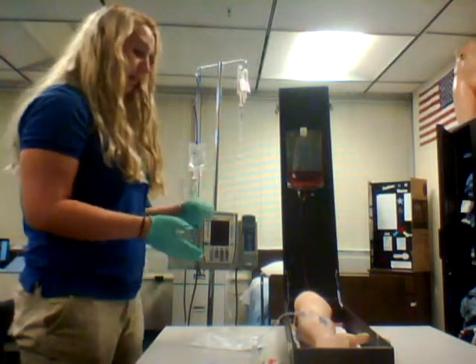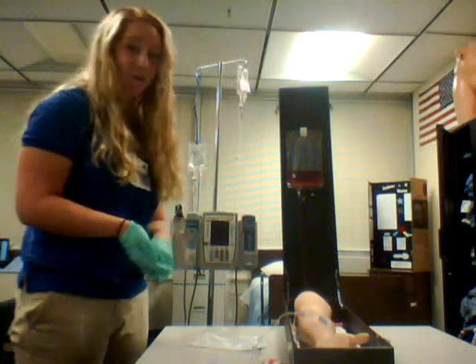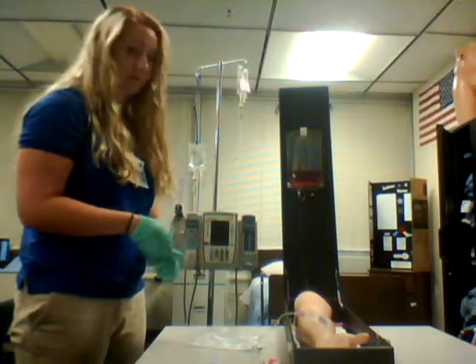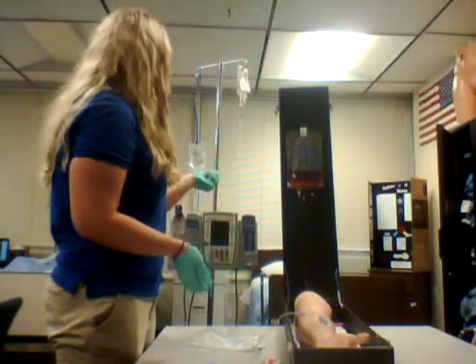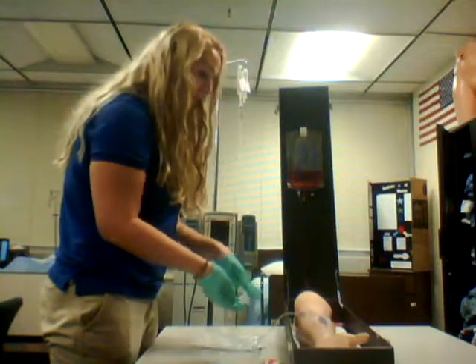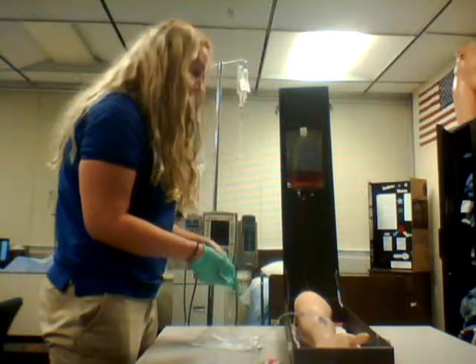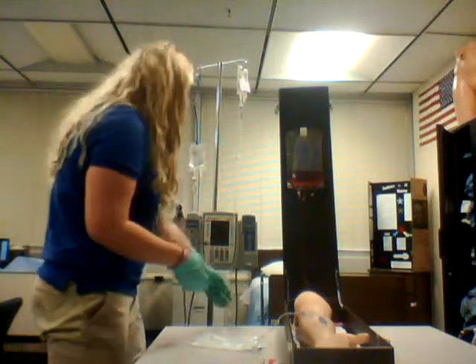Before I would leave though, I would observe for any signs of medication reaction, infiltration of the IV site. I'm going to come back, reassess after the medication is complete, reassess the patient's IV site, make sure no infiltration, phlebitis, any reactions to the medication. And I'm going to clamp off my piggyback tubing.